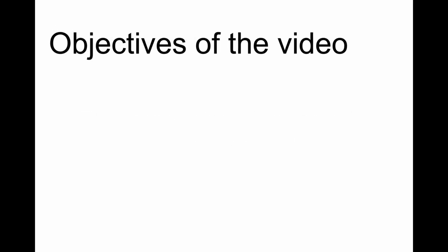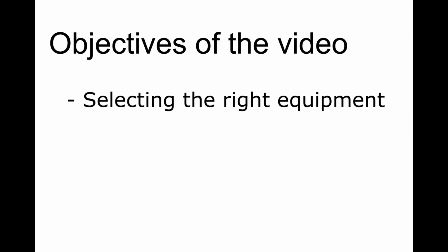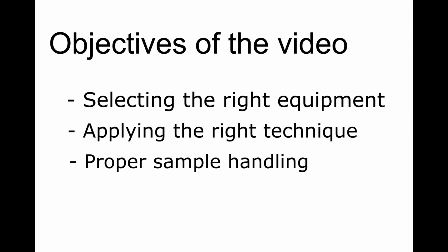The objective of this video is to give an insight into the process of selecting the right equipment, applying the right technique, and an overview to the processes involved in the handling and delivery of samples.